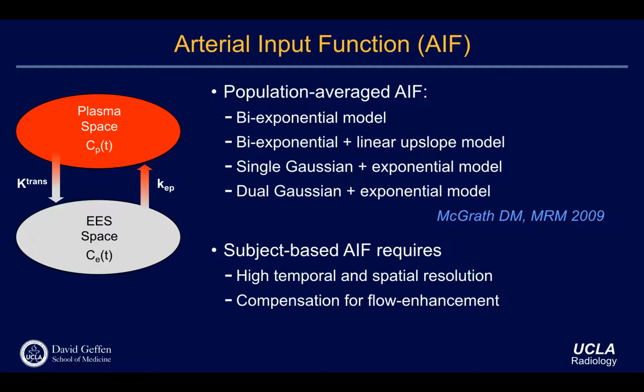But the tricky thing is, if you look at the vessel changes, it changes really fast, right? This is not about subtle changes. The input function should be earlier and much higher, something like this. So you have to find a way to capture that, which means you need very high spatial resolution because the vessels are small, and high temporal resolution because it changes really fast. And I'm not sure Dan covered it, but there are a lot of flow-related issues.